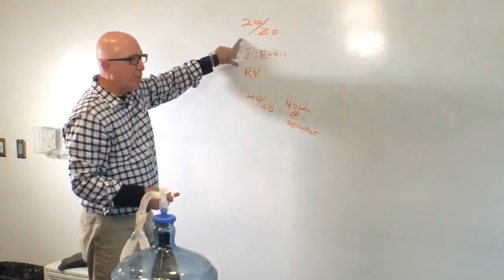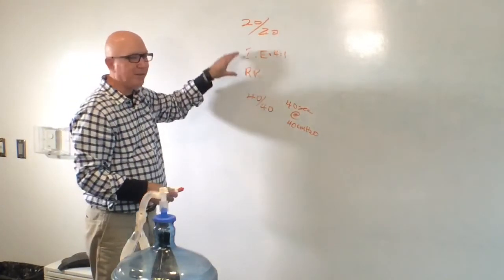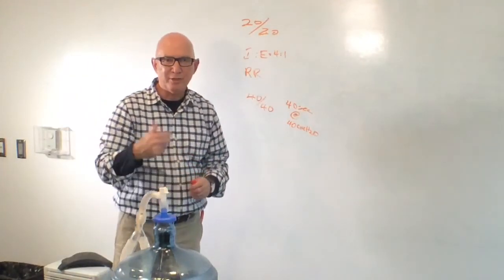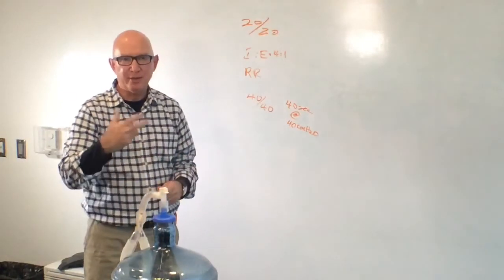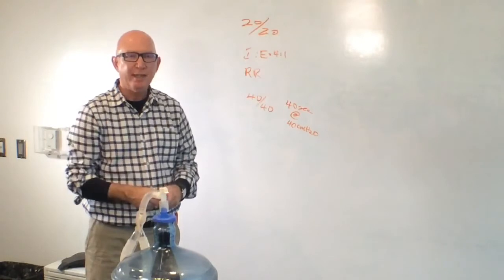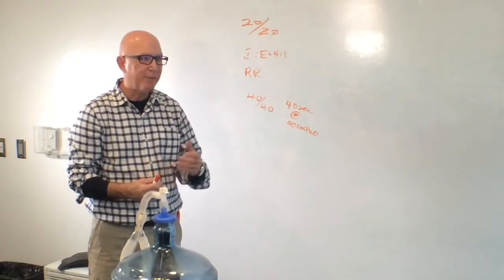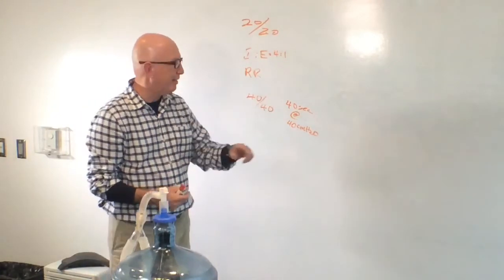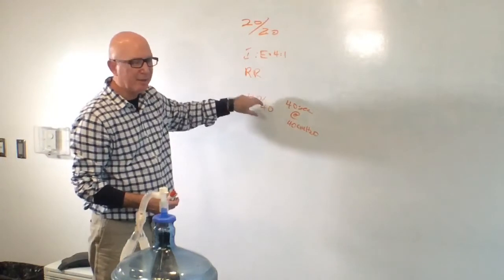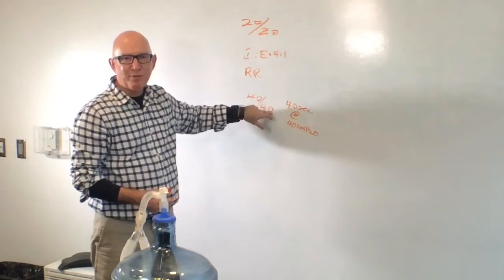So the question I had was, with this particular maneuver, what are the chances of generating a pneumothorax and making things worse for the patient? The literature talks about the fact that recruitment maneuvers, one of the risks are pneumothoraces. There are other risks as well, such as volutrauma that doesn't necessarily mean a pneumothorax. It does have an effect on your cardiac output as well, and your patients have to be reasonably well sedated, because think about this, for 40 seconds at 40 centimeters of water, you don't necessarily want spontaneous breaths in there. That would be uncomfortable for a patient.